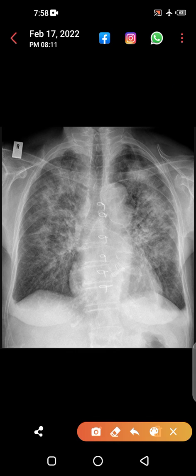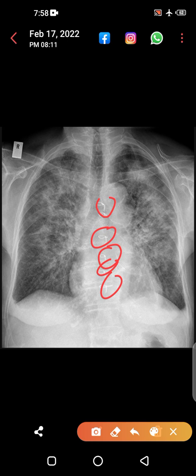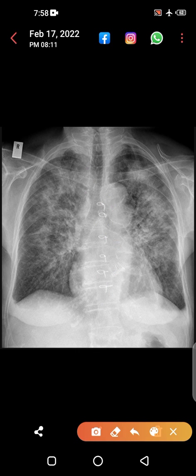Can you appreciate these sternotomy wires? If you see these types of wires in an X-ray, these are called sternotomy wires. This means the sternum of this patient was opened previously.